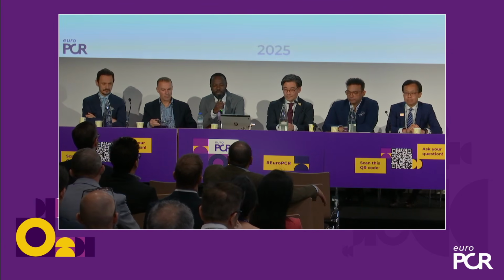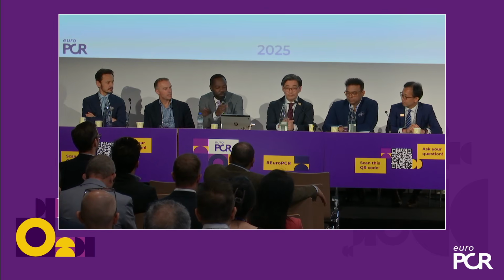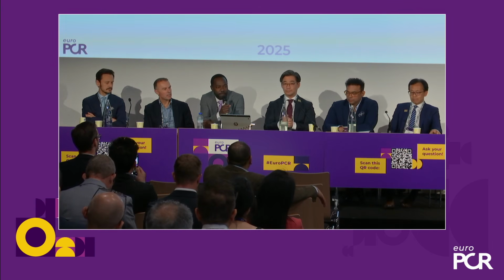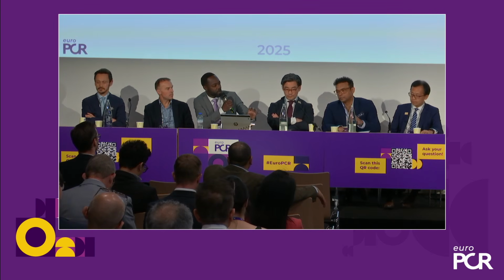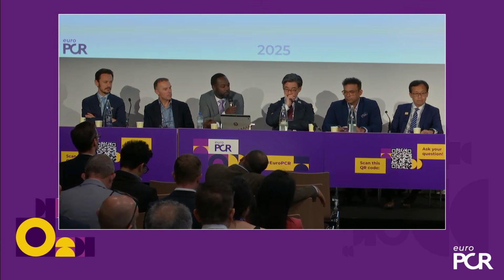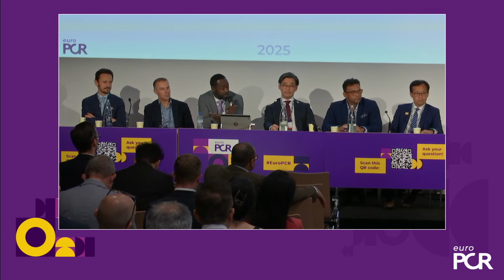So thank you very much, Masa. This was a very interesting talk. It's always a surprise to me because, coming from a Western country, we see slightly different findings. If I understood you correctly, if you compare self-expanding platforms in small aortic annuli, this intra-annular platform may achieve better hemodynamics than a supra-annular one. What do you think is the main reason? Does it have something to do with the shape of the stent frame, the way the leaflets expand?